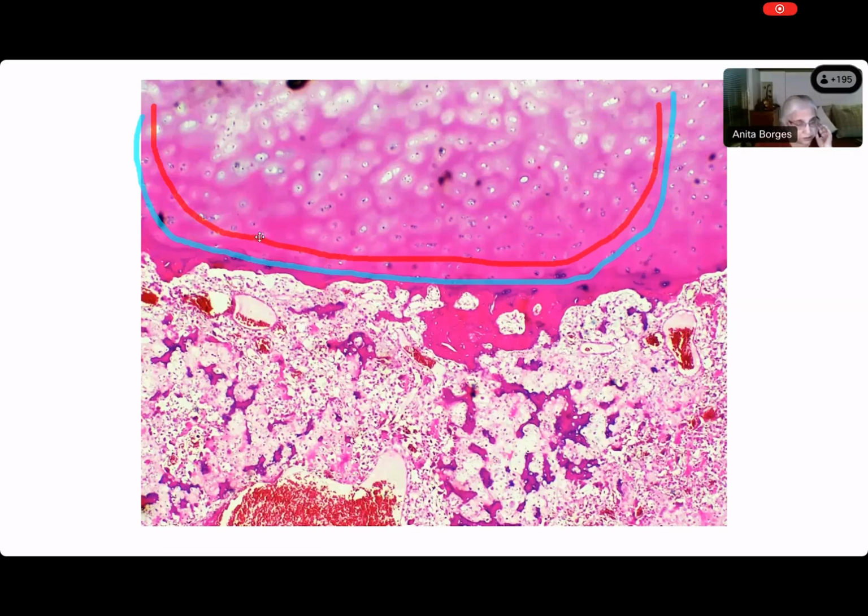This is bone. Okay, Monica thinks it is bone. Mansi thinks it is bone. I think Sarangi thought it was a lot more cartilage in the tumor. Who have we got over here? Hema, tell me. It is cartilage. All right, very good.